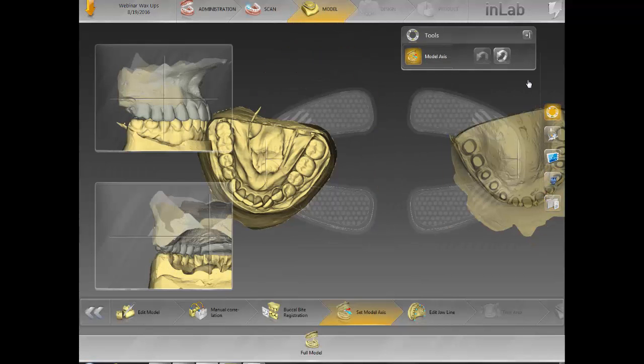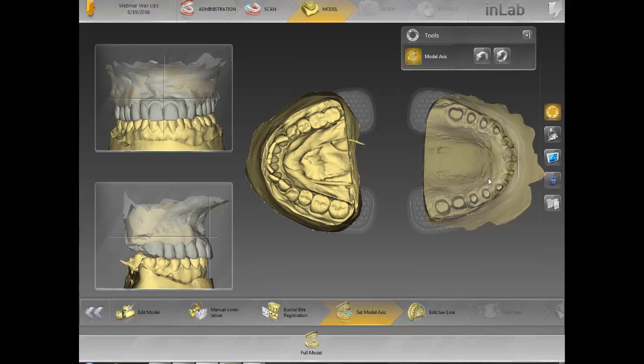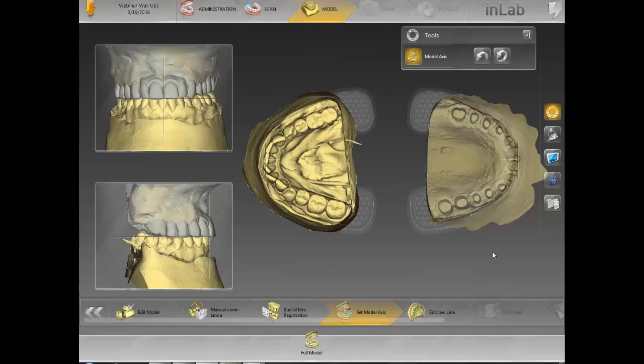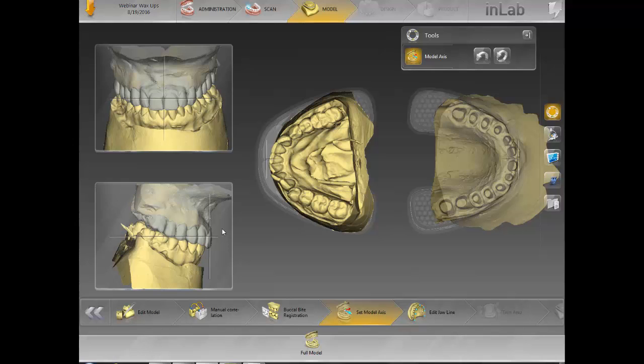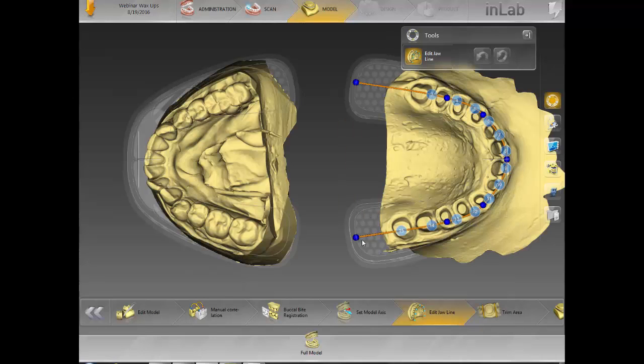If somebody wants to ask me a question about why I do this, you can ask me at the end. I'll set my model axis. The way I set my model axis is a little bit different than most — it solves a couple issues that come up once you're designing the case. I always tilt my model a little bit instead of setting it according to the default lines, so I can see all the margins on all the different preps. After I do that, I click on edit jawline. Once we get to the next step, we edit our jawlines.